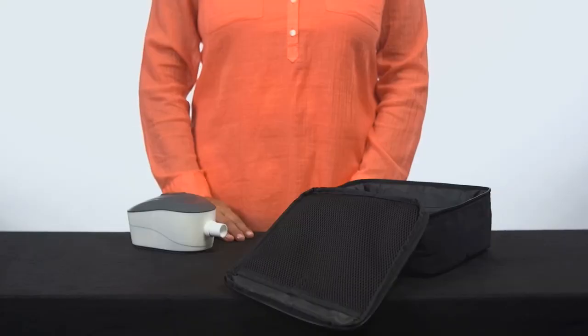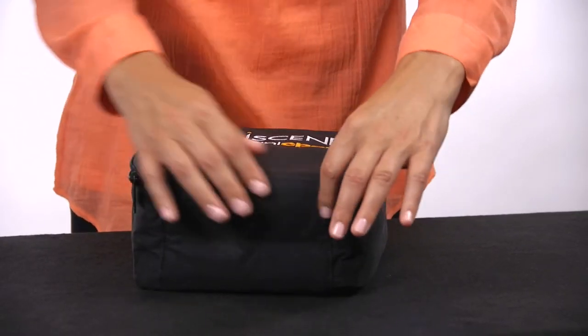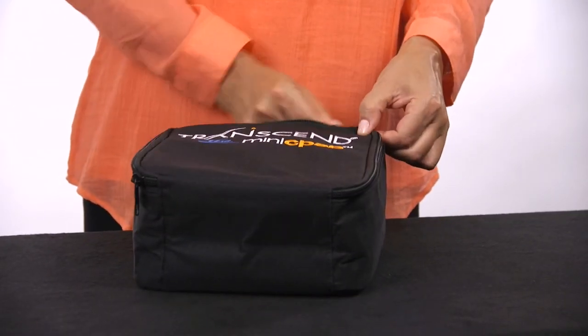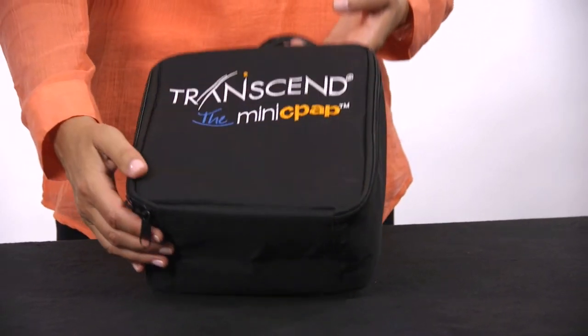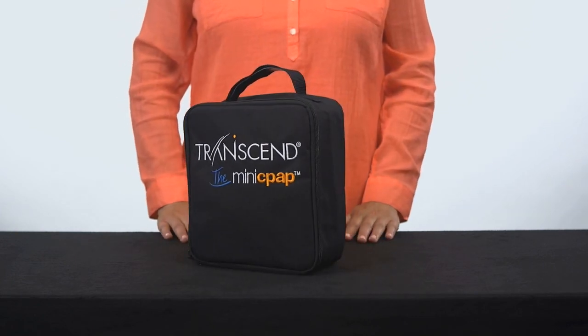Enjoy the freedom to sleep anywhere with Transcend 3 Mini CPAP. Whether you travel for work or play, its small size and variety of power accessories make it the most versatile portable CPAP for therapy on the go.